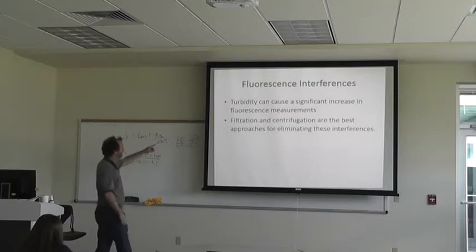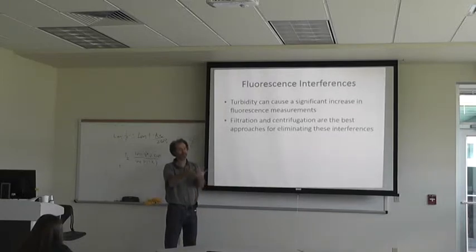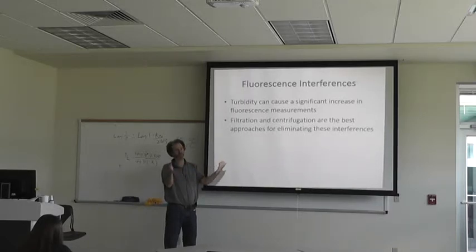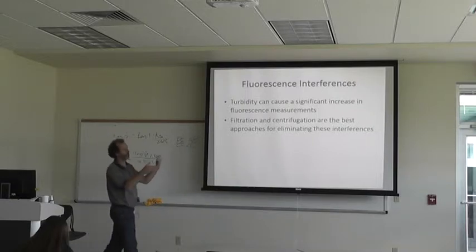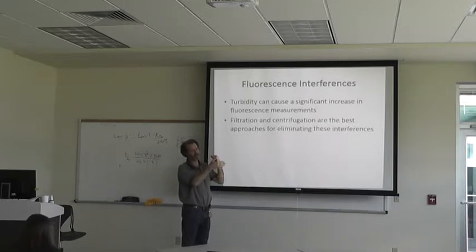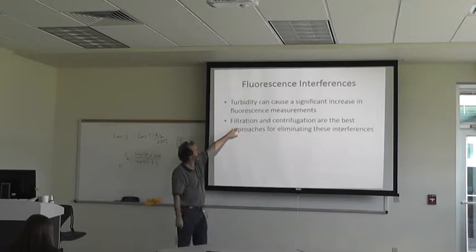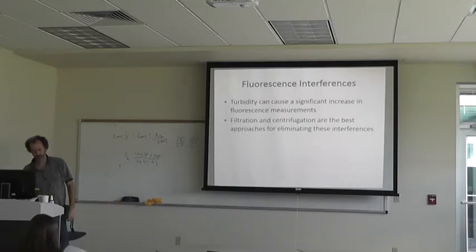Fluorescence interferences: turbidity can cause a significant increase in fluorescence measurements, because you're shining light to excite the fluorophore and then measuring the amount of light emitted at a 90-degree angle, typically. This is similar to nephelometry — in nephelometry you're actually looking for that scatter. But you don't want the light to scatter to the fluorescence detector; you want it to fluoresce from the fluorophore. Filtration and centrifugation are the best approaches for eliminating lipemic or turbid samples.